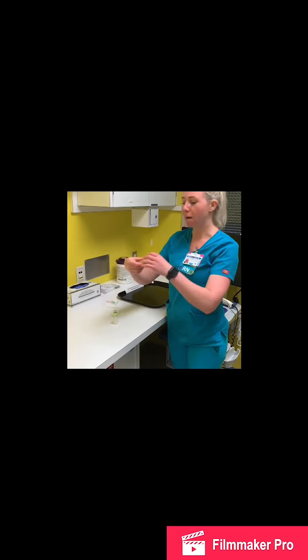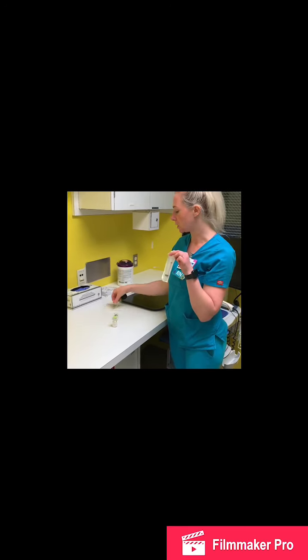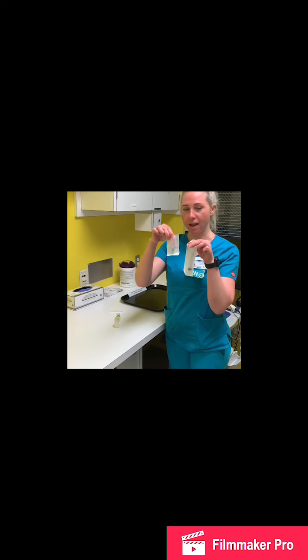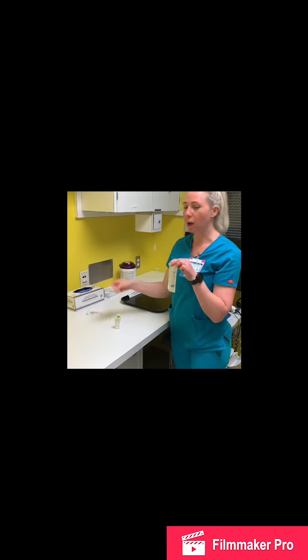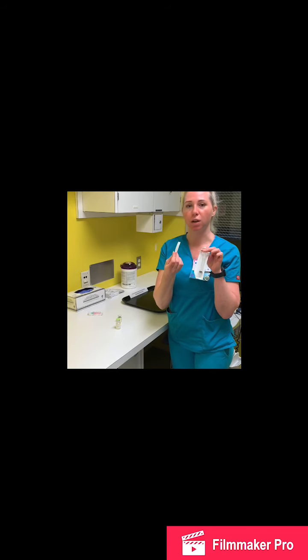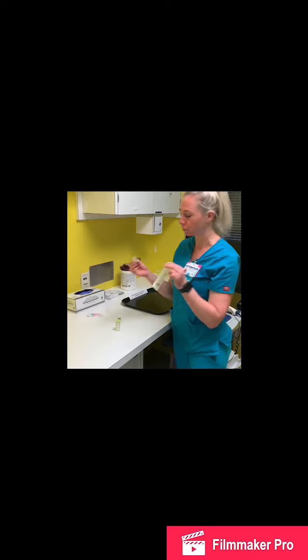I also have my 10 ml syringe because my diluent is 10 mils for my medication. I have a needle to withdraw the diluent and inject into the medication with. And then I also have a blunt cannula just to place on the end of my syringe when I'm finished reconstituting to safely and sterilely carry the medication into the patient's room.